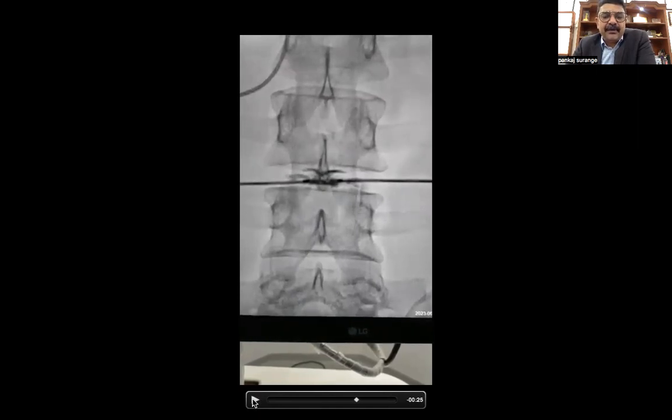After doing that, you can see here, this is the probe we have inserted through that cannula. You can see this marking over here, and you can see the distance between these two. So that is the ideal location. We have to cross the entire medial pedicular line and reach the center over here. In the lateral view, it should be in the posterior part of the annulus. So this is how we do it. You can see both the markings over here.